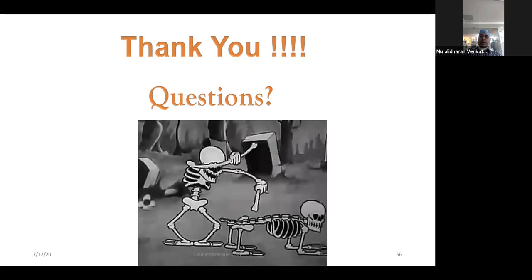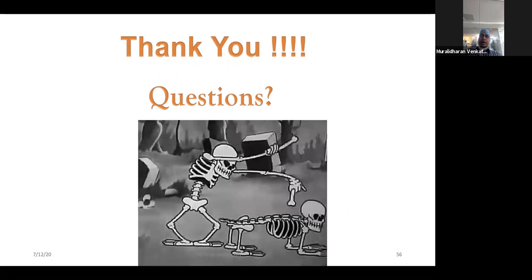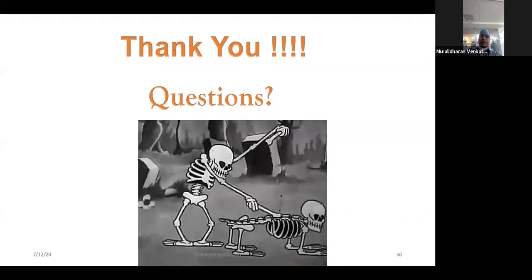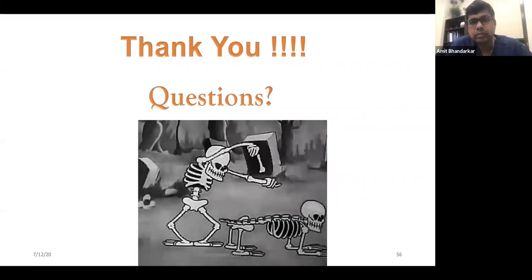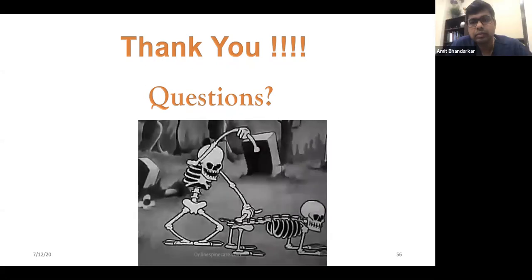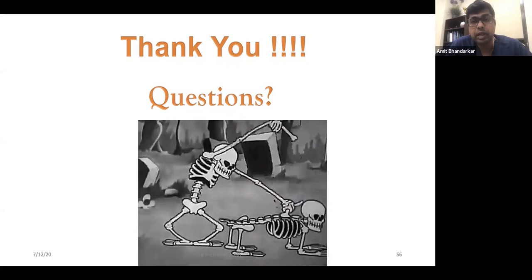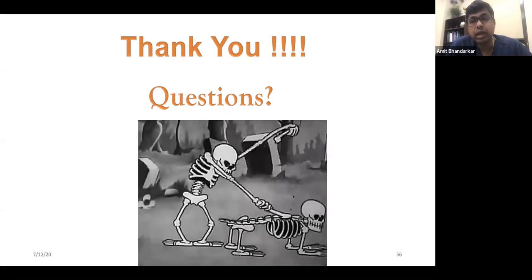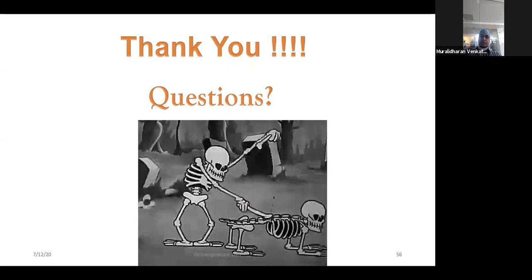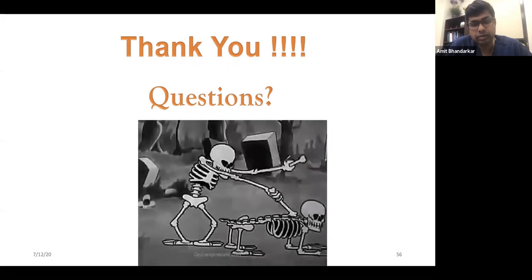Okay. I also see the unilateral instrumentation. We do unilateral pedicle instrumentation for the TLIF, but our selection criteria are very stringent, and we don't use unilateral instrumentation if they are osteoporotic. Yeah, same for me. The patient that I showed you did not have any pedicle on the other side, so I was forced to do unilateral. I'm not a big fan of unilateral fixation. I do bilateral fixation in all my patients.